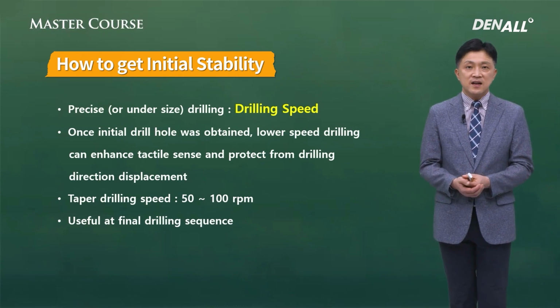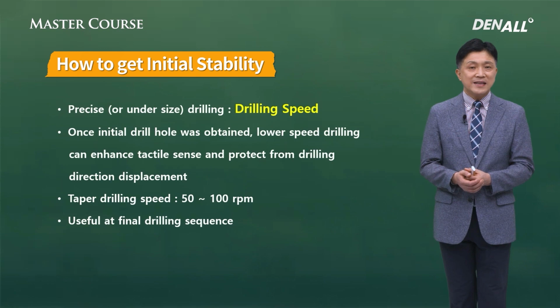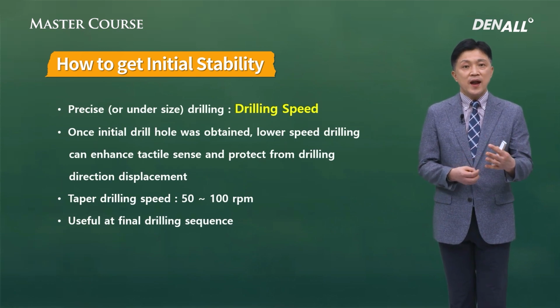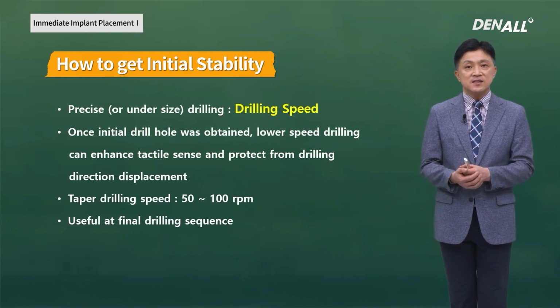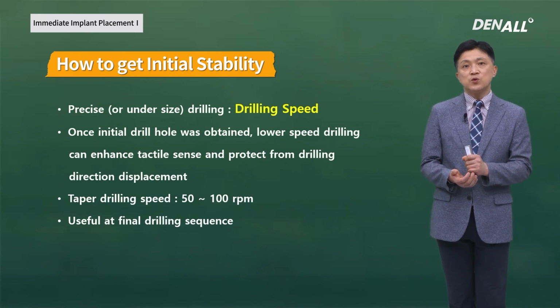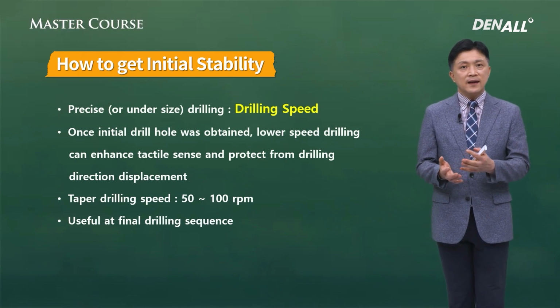Third, I've talked about how high-speed drilling is recommended for initial drilling, but at times low speed can be favorable. In the final drilling step, it is better to do low speed. To get better primary stability, you can do undersized drilling. That is recommended in a lot of cases. When the RPM increases, the cutting power of the drill goes up. However, the tactile sense we get with our hands drops, and if the drill RPM gets lower, the cutting power drops. However, the tactile sense goes up.